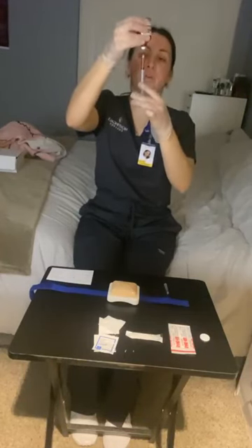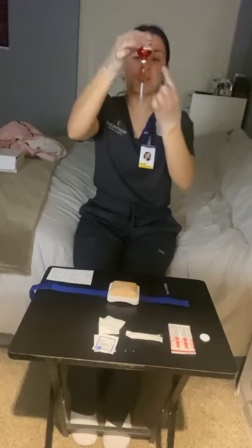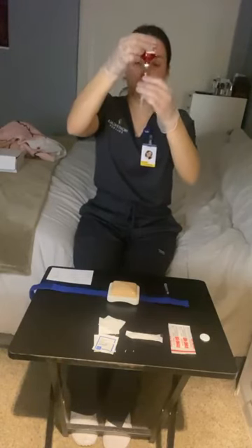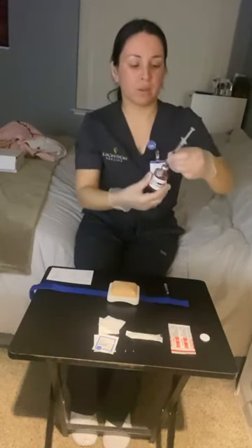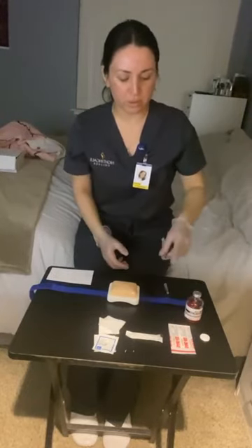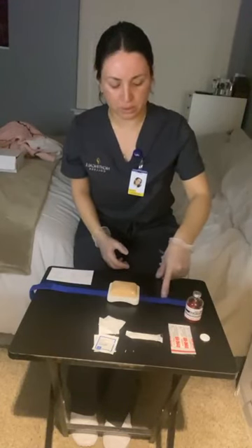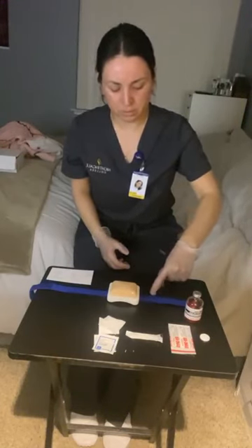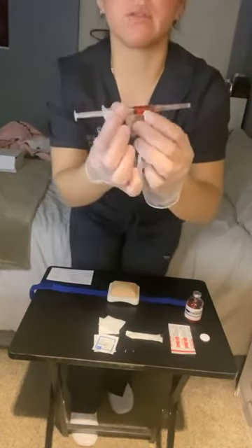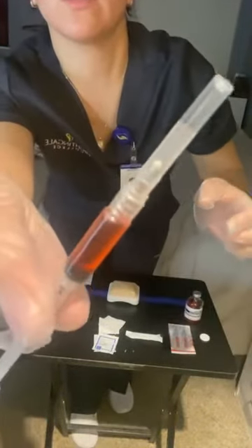If there were still air bubbles, I would push back on the plunger to get the air back into the medication vial, and I would go back and pull back on the plunger to get the correct dose. So without touching anything, keeping the needle clean, I'm going to use the one-hand scoop method to place the cap back on. And I'm going to show you guys that I've got 1.5 milliliters of the medication.